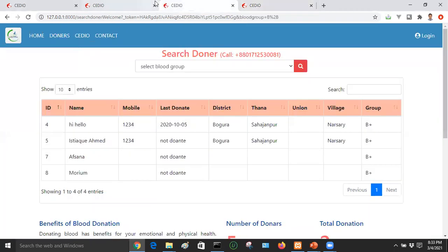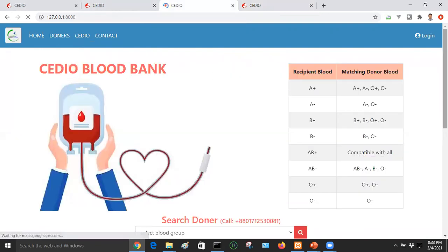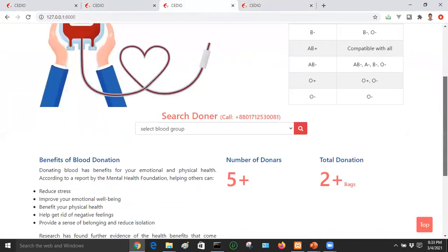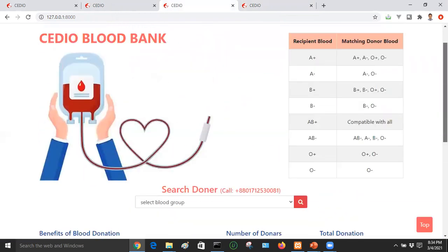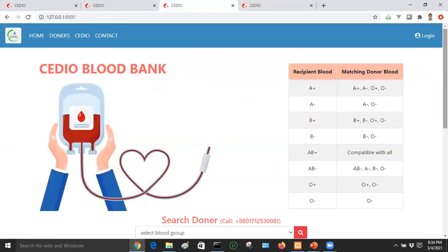Thank you very much. We have presented the Blood Bank Management system. This concludes the first demonstration.